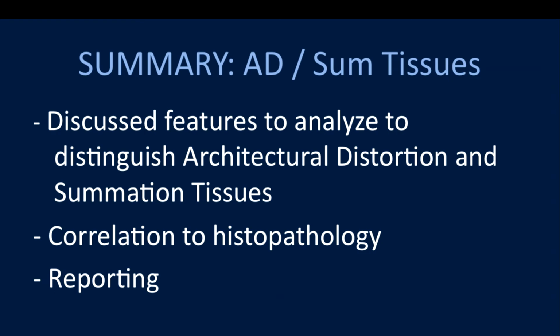We'll take one last question. Yeah. We've done many tomo-guided biopsies. Can you go to the microphone, ma'am? We have done a lot of tomo biopsies, and we find there's a lot of distortion after biopsies. So to follow a distortion with a benign histology doesn't work, because you have more distortion after the biopsy. So we don't follow distortion because of that reason. There's a lot more distortion because we want to get an adequate sample, so we tend to get more tissue with a 9-gauge needle.